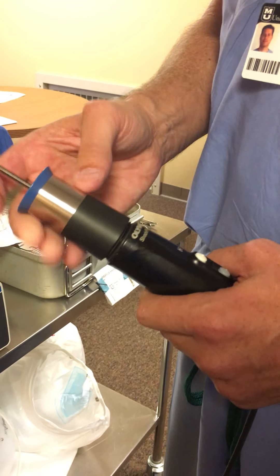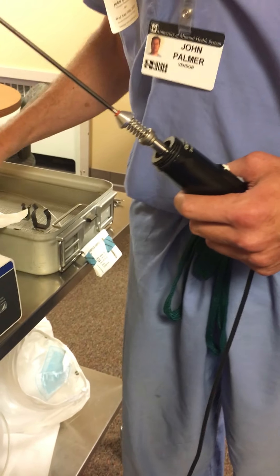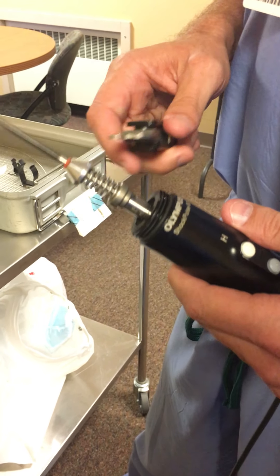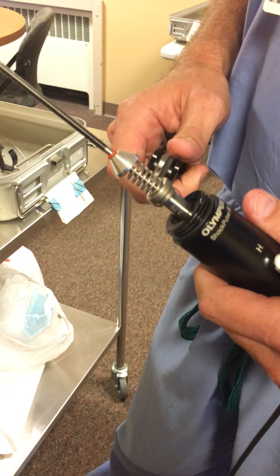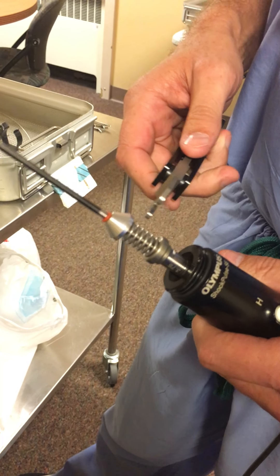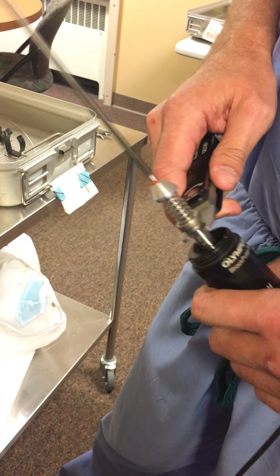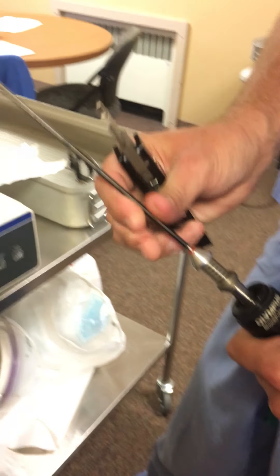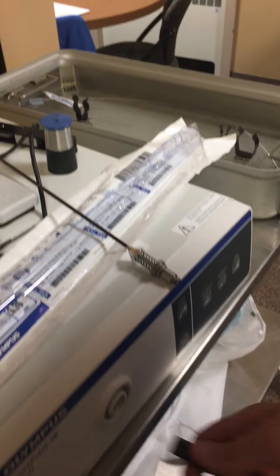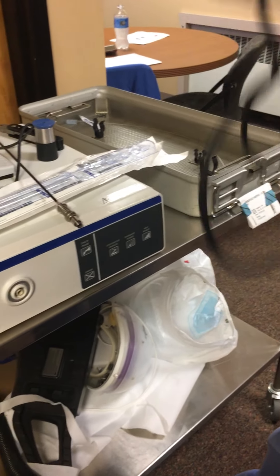At the end of the case, power the unit down. The probe is going to be discarded — unscrew it. Keep in mind this uses ultrasonic energy, so thousands of repetitions have gone through it. It can get a little warm and may be tightened, so it may take a little more muscle to release. Go counterclockwise to release it, then unscrew it. The probe is thrown away in your sharps container, and everything else goes back into the tray.